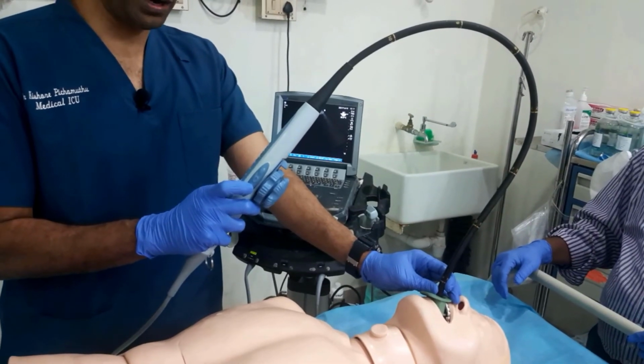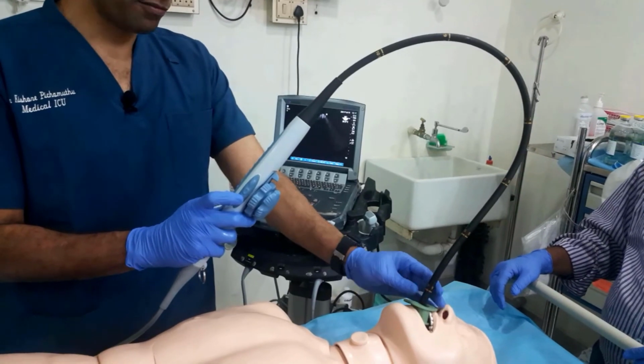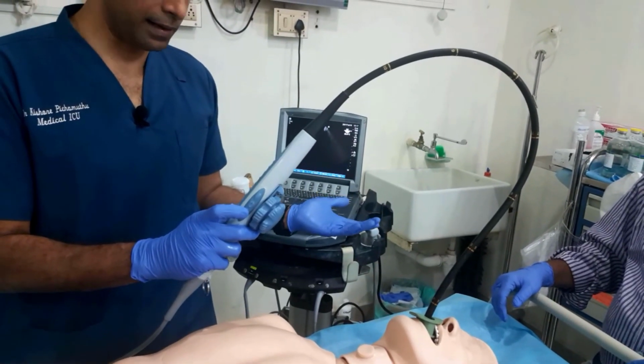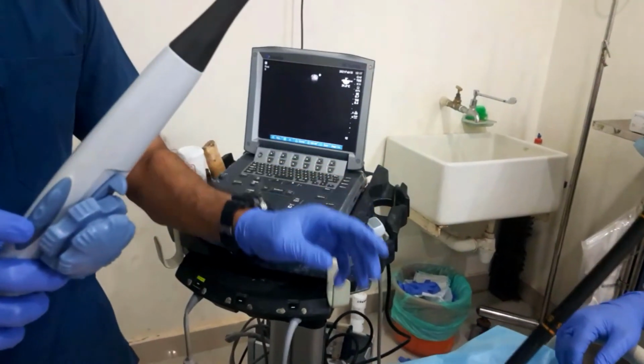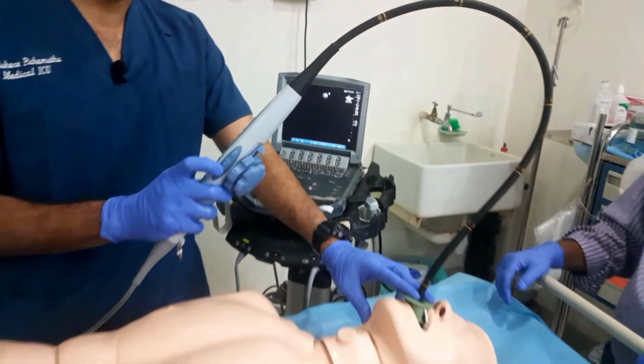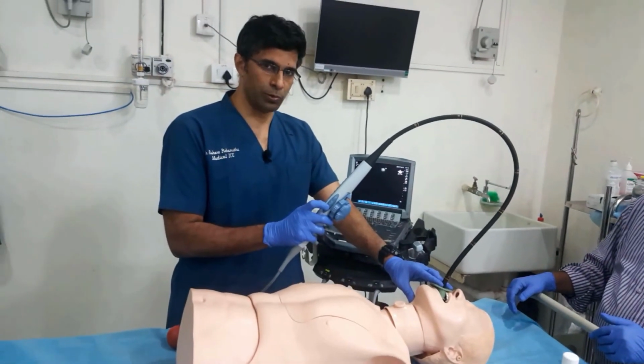if we wish to look at it in short axis, what we need to do is just change the angle of the beam from 90 degrees that it is at currently back to 0. So I'm just doing that and it's back to 0. And once I do that, the view that I get is the mid-esophageal descending aorta short axis view.